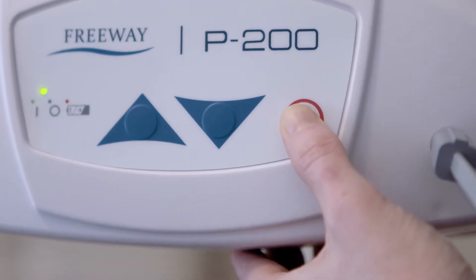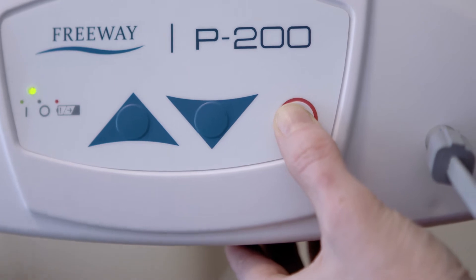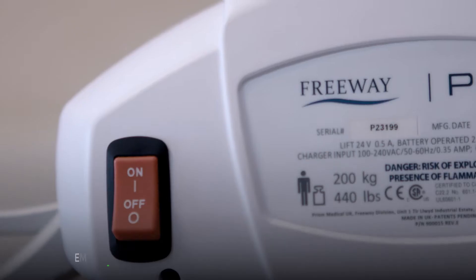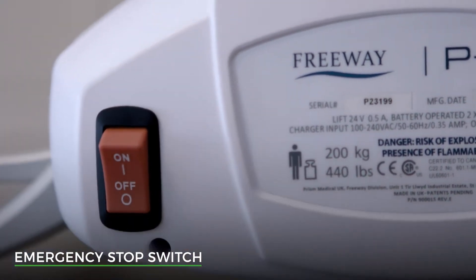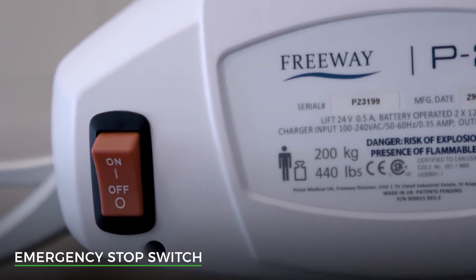You will hear a beeping sound as it lowers. If this emergency lowering button needs to be activated, you must stop using the hoist and contact AdaCare for an immediate service. If the hoist needs to be stopped in the event of an emergency, the emergency stop switch should be turned to OFF. This prevents all power getting to the motor, immediately stopping movement. It will also need to be activated if there is a function failure — if this is the case, stop using the hoist and contact AdaCare for a service.